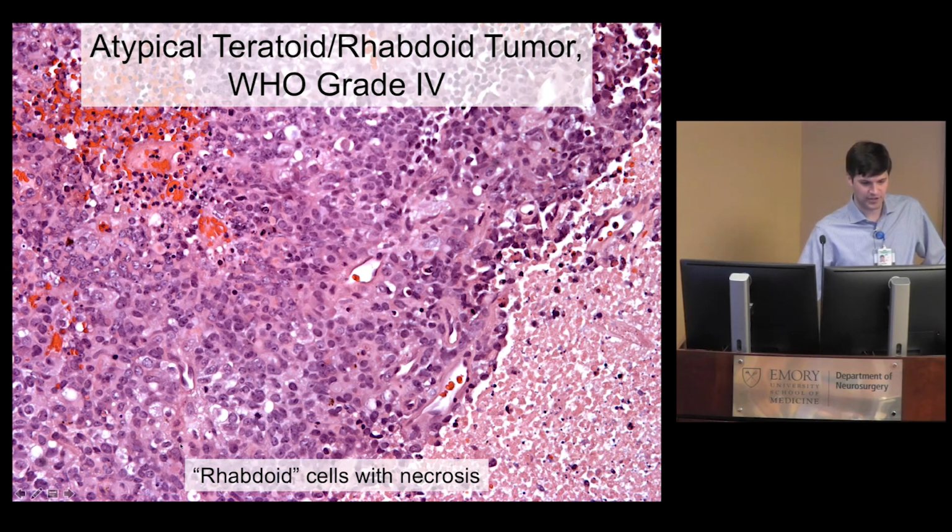And these concretions will indent and displace the nucleus. So the nucleus is kind of off to the side of the cell, and this big pink blob is in the middle of the cell, and the nucleus has a big nucleolus staring back at you. In general, these are extremely aggressive and dire clinical situations.